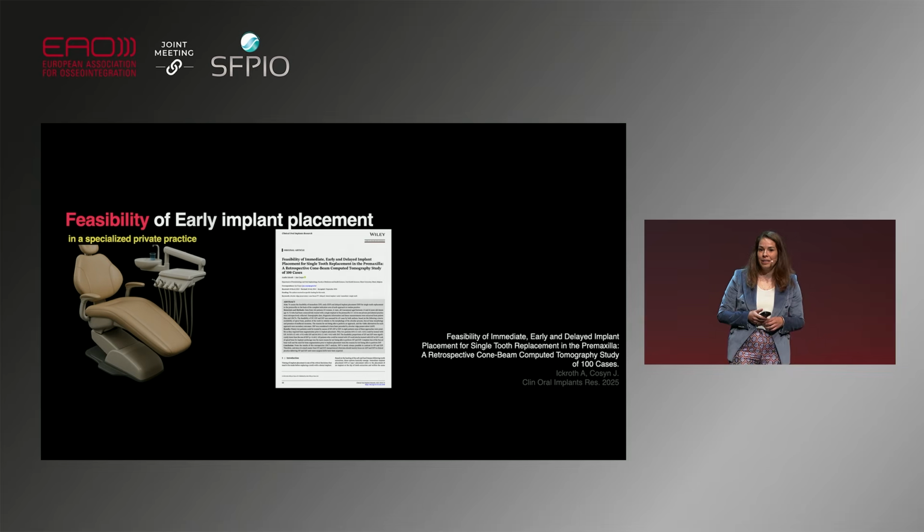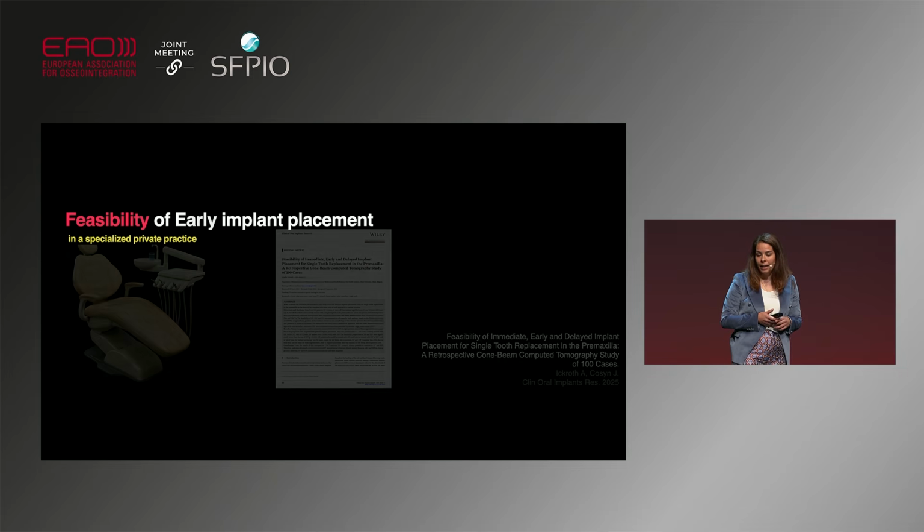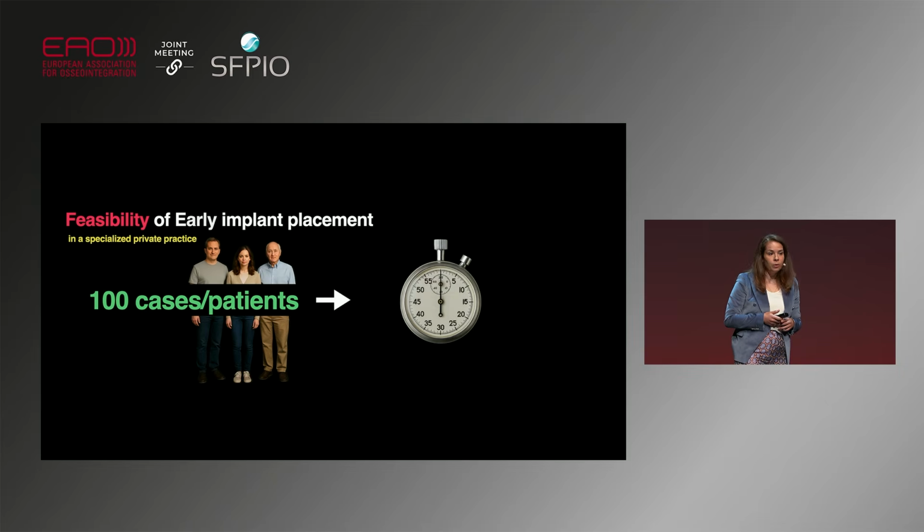What he did with his group, he did a really nice study retrospectively about timing, about the feasibility. They looked retrospectively at 100 cases, 100 patients. And then they looked at when and how often a certain timing, immediate, early, or delayed, was feasible.